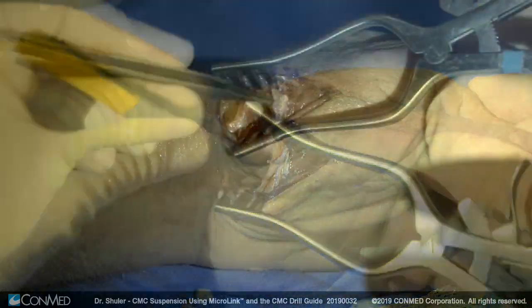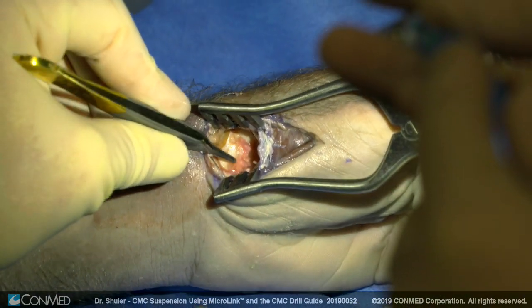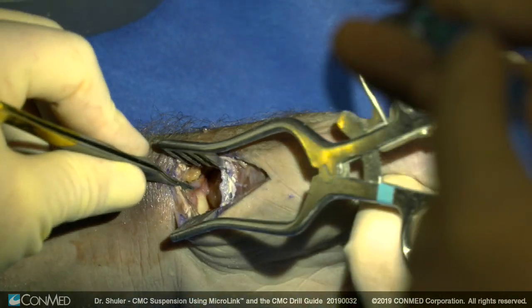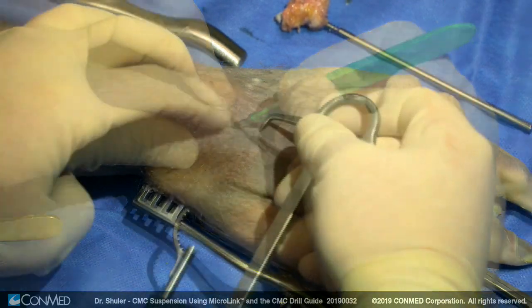Once the trapezium is completely removed, the flexor carpi radialis is checked to be intact and not transected. In this view, you can see the trapezoid, the base of the index metacarpal, and the scaphoid following complete excision of the trapezium.